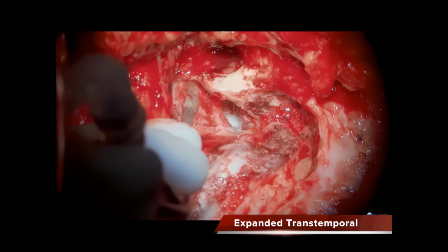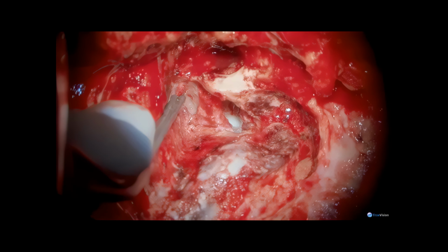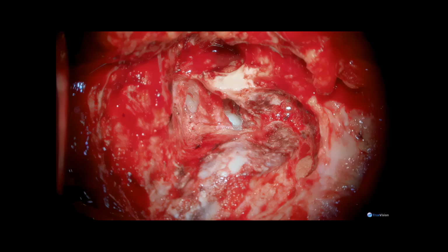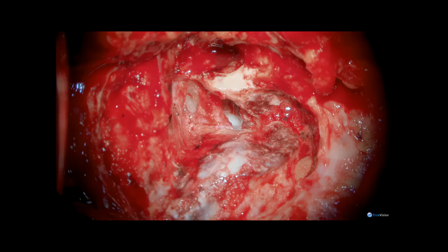The transtemporal dissection has been completed. You can see the internal auditory canal, the posterior fossa dura, the middle fossa dura, and the sigmoid sinus. The external auditory canal has been removed and the facial nerve fully preserved.